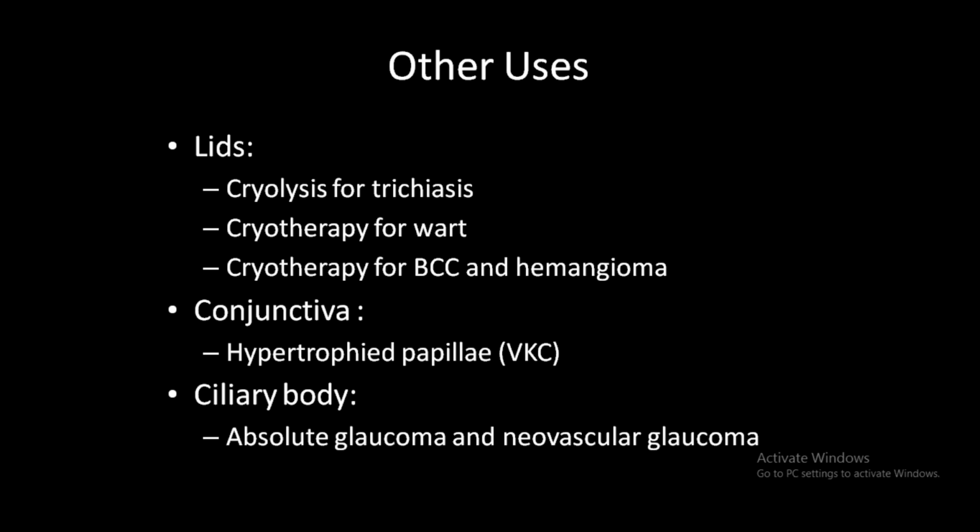So in brief, I have just covered what laser is, what the mechanism of action is, how it acts, what the pigments which absorb laser are, and what the clinical applications of laser are. And I have also covered what cryotherapy is. You just have to know the indications of laser, types of laser, indications of cryo, and the mechanism of action of laser and cryo. It is given in your textbook.